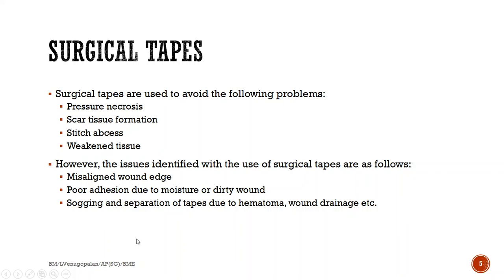Hi class, welcome again to another session on biomaterials. So we have been discussing soft tissue implants from our fourth unit. We already discussed sutures in the last video. So let us move on to discussing surgical tapes now.